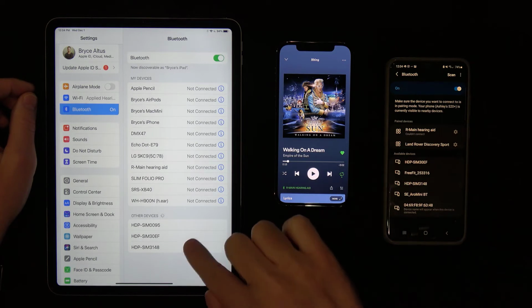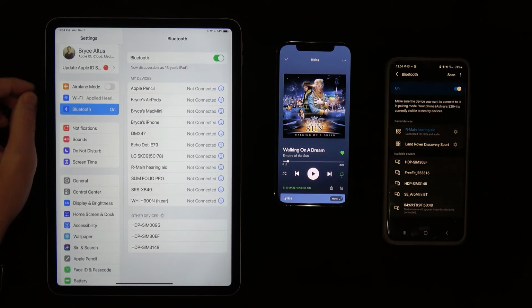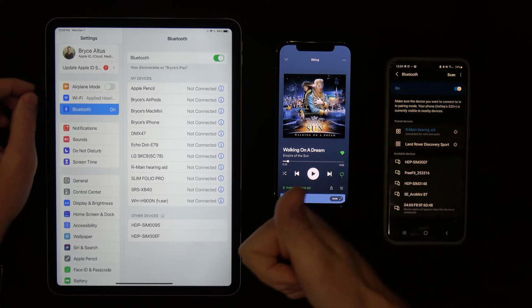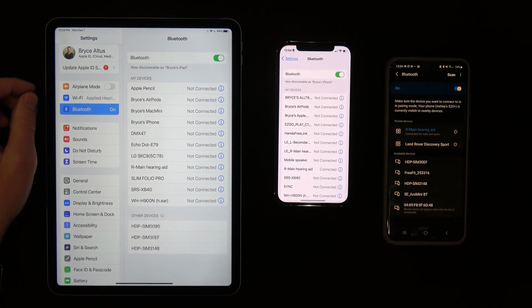Once the hearing aids are disconnected from the iPad, simply tap on the hearing aids in the Bluetooth menu on the Android, and your hearing aids should then connect right up, since now we have an available connection slot available to us.